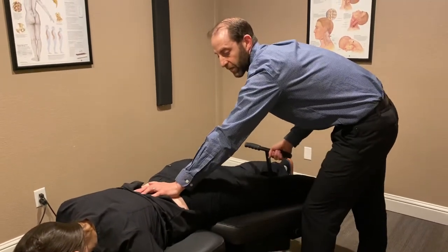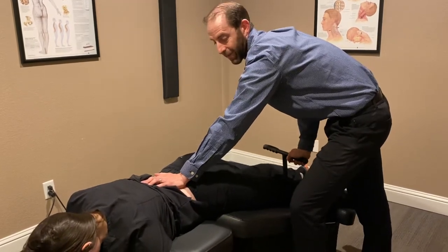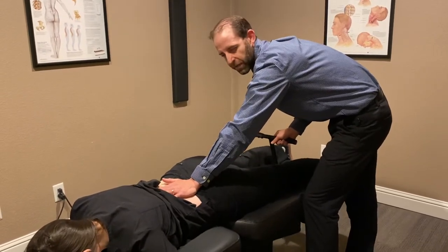We've been finding very good use of this table for our elderly patients or patients that have recent injuries. It's just a nice table that won't usually cause a flare.